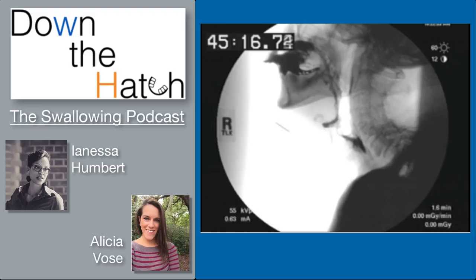We should first consider broader categories: is this an airway protection issue, a bolus efficiency issue, or both? It seems that in this swallow there was both — we could see moments where this person was penetrating and pushing it back out, in addition to quite a bit of residue. Then we can move forward to look through all of these swallowing events and see which is contributing to airway protection, bolus efficiency, or both.